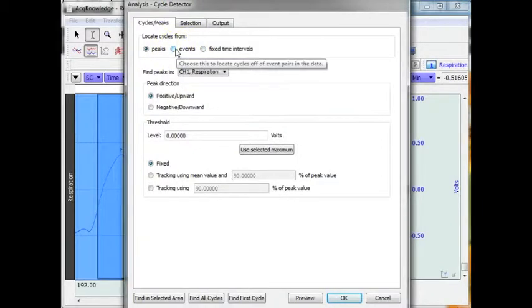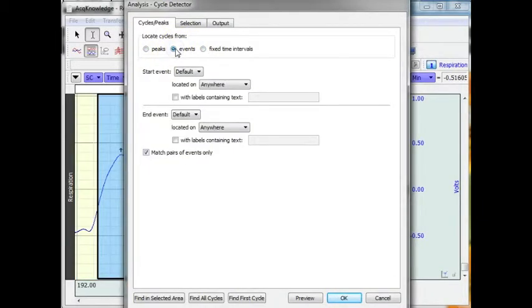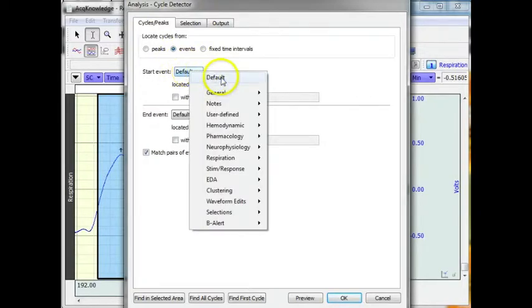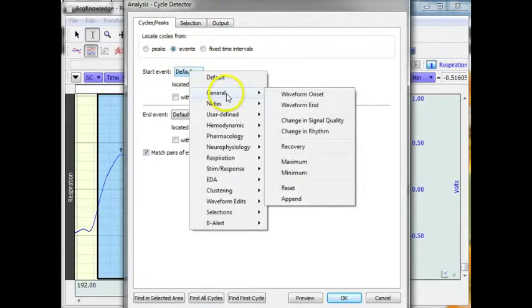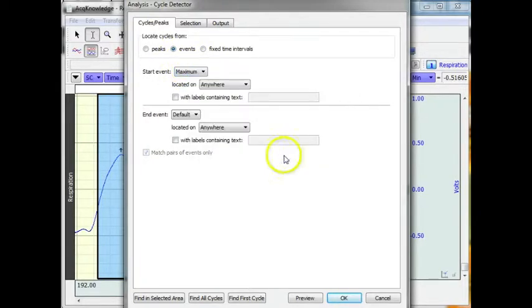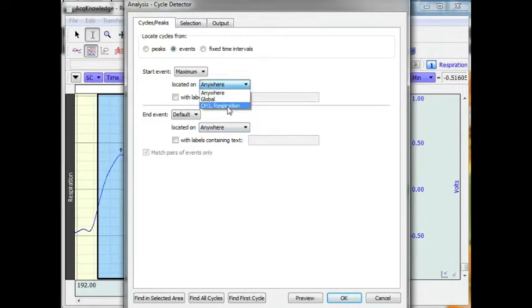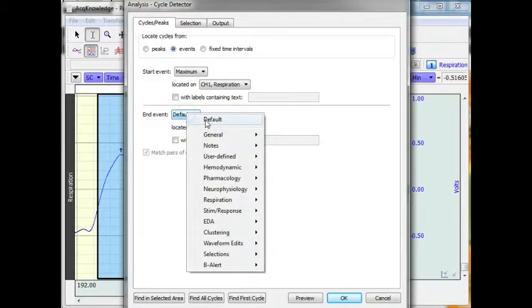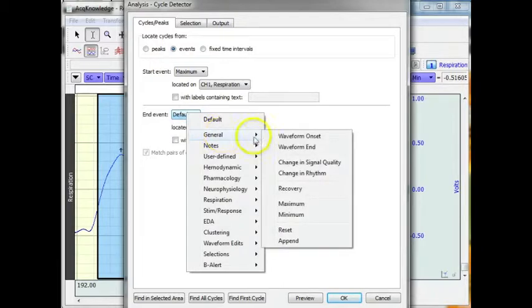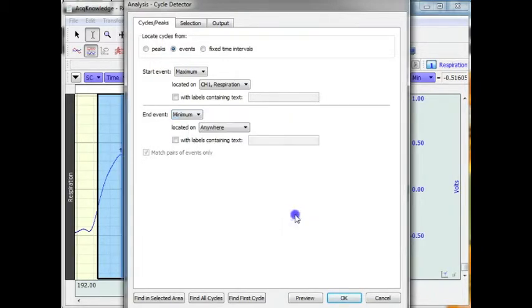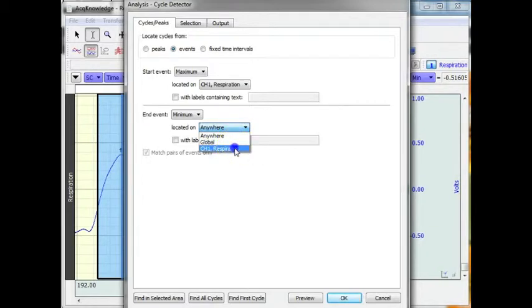Open the dialog up. This time instead of locating a peak, I am actually locating an event. And I want to find maximum marker on my respiration. And I am going to find the minimum on the same signal.